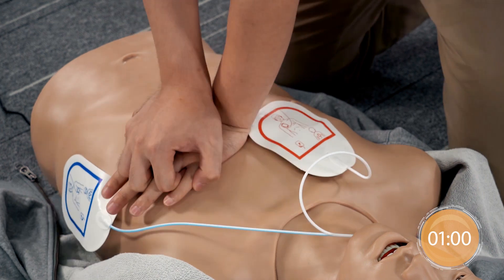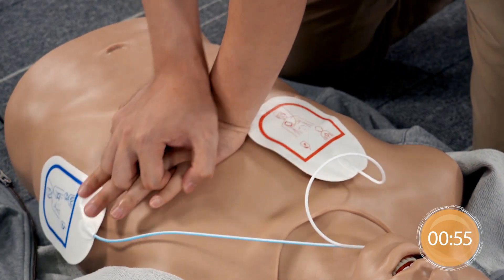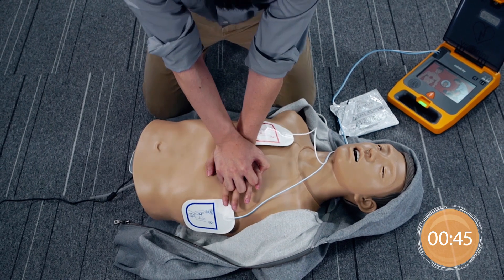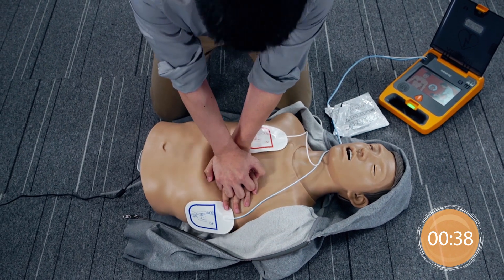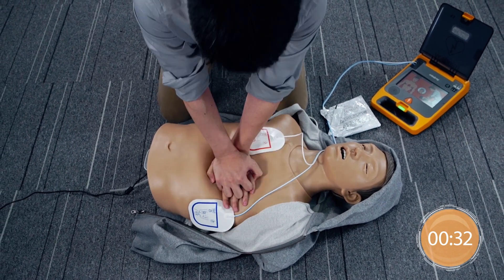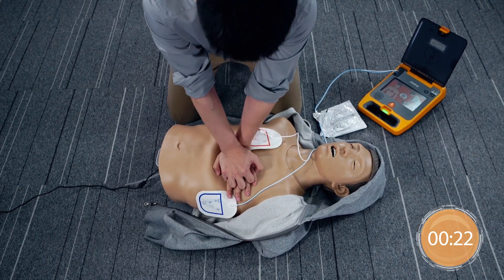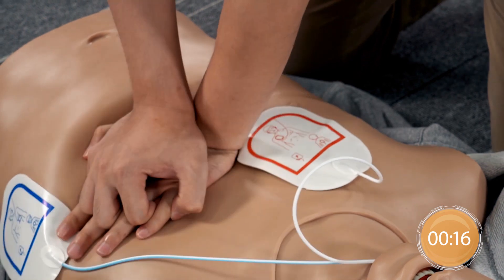Interlock the fingers. Give chest compressions immediately. 100 compressions remaining. Continue to push down hard. 50 compressions remaining. Give chest compressions immediately.